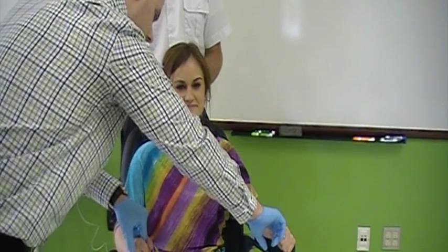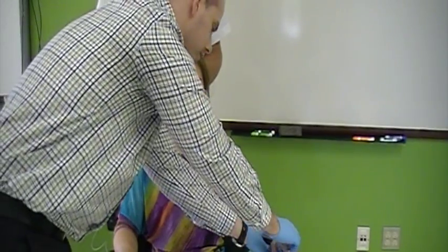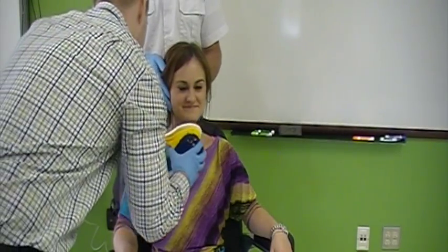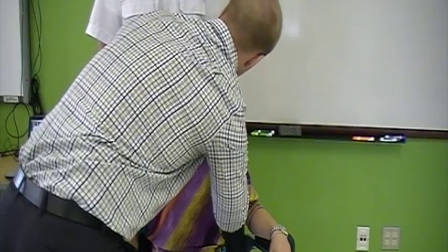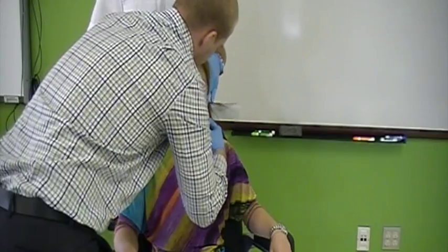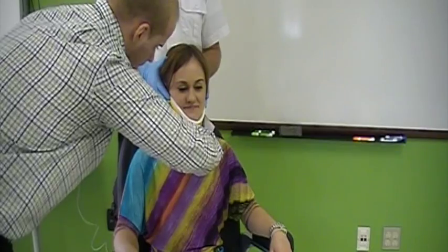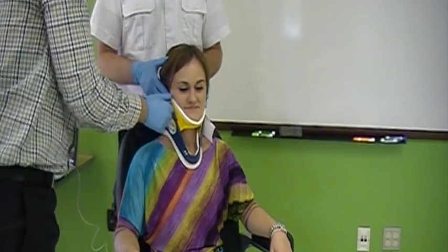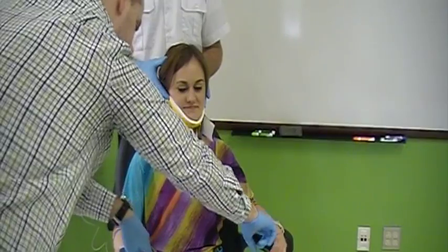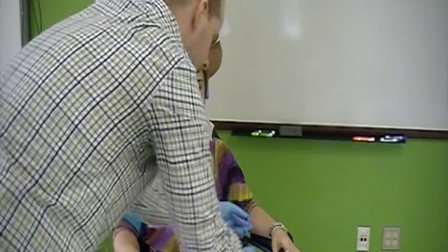First perform a brief neurological assessment. Select the appropriate size collar and position it around the patient's neck. Secure the collar with a Velcro strap and confirm proper placement. Repeat neurological assessment and ensure no deficits were created.